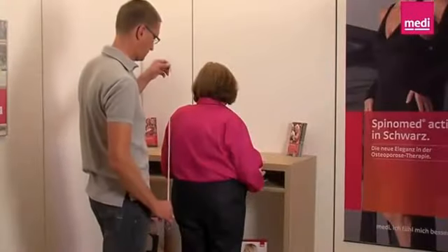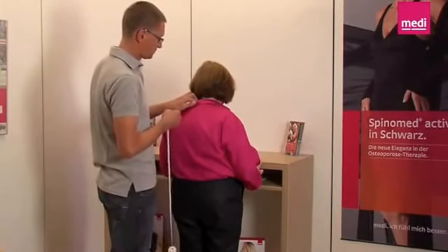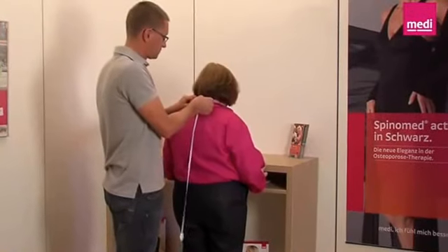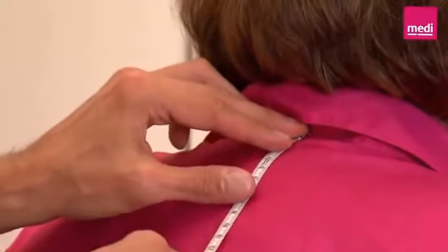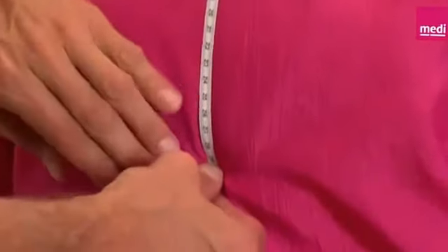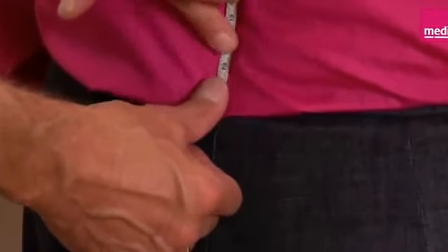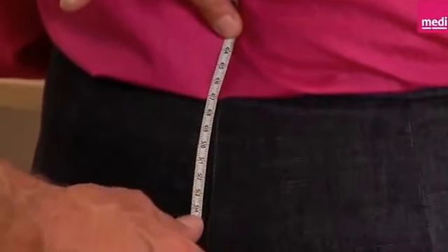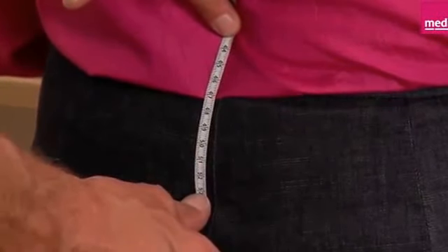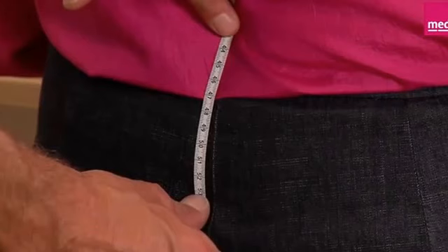Measuring. To select the specific size of the SpinoMed spinal brace, first determine the length of the back splint. Palpate the C7 cervical vertebra and, starting from it, measure over the entire spine to the sacrum, making sure that the tape measure follows the spinal curvature over the entire path of the spine. Now that the distance from C7 to the sacrum has been determined, you can decide on the right size of back splint from the product table.